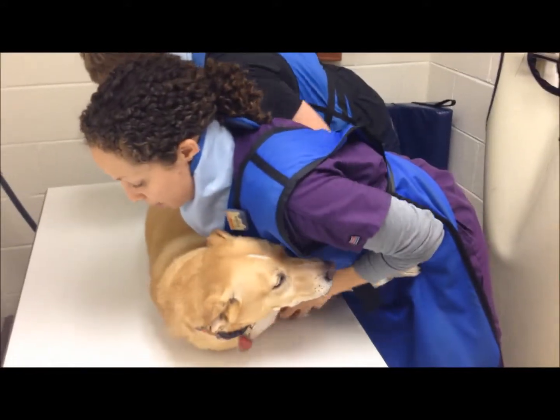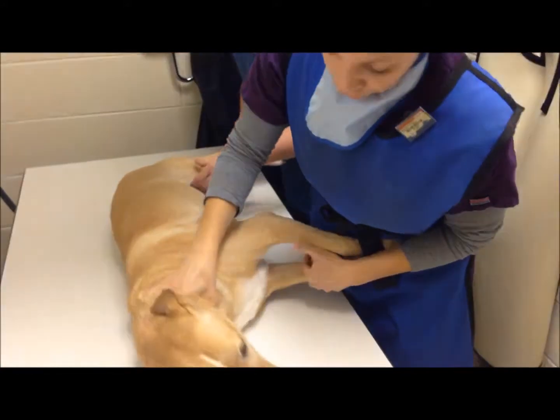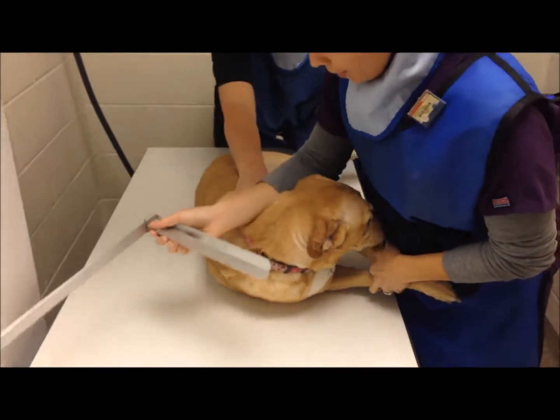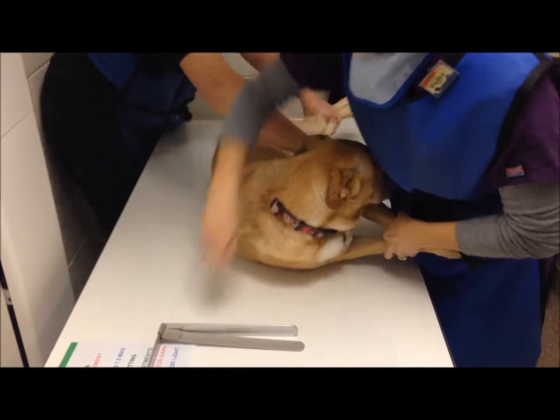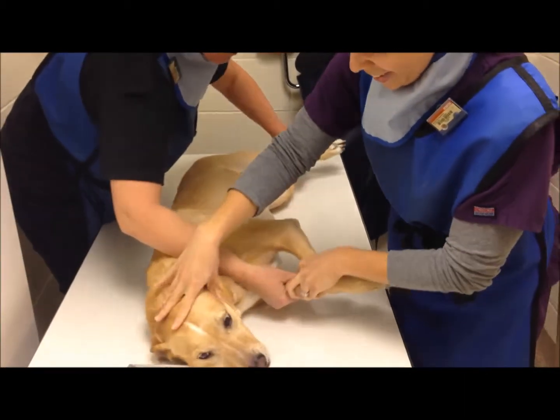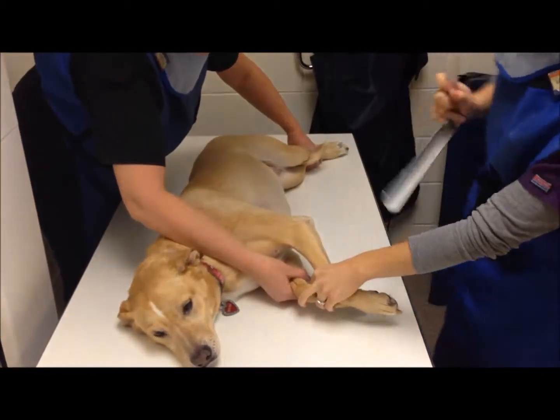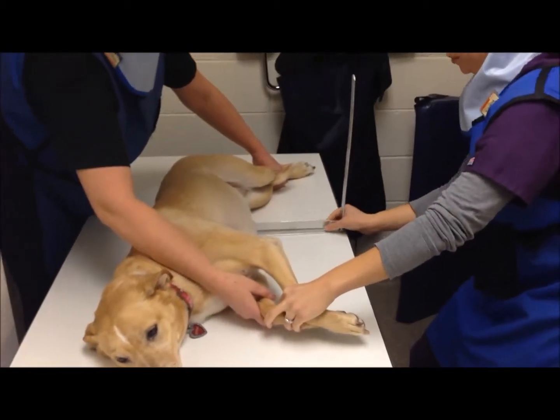And this is positioning for a right lateral. You can do left lateral, but in this instance we're going to do right. Let's see if she will. I know, you're nervous. Alright, so now that she's in position, we've got our calipers.